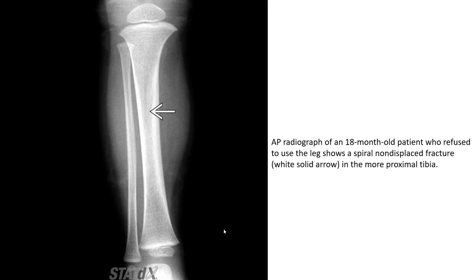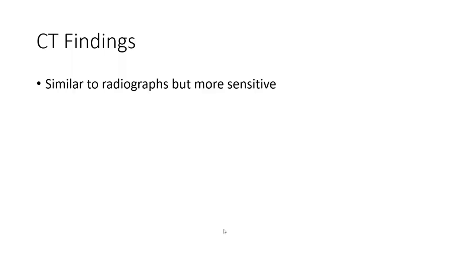AP radiograph of an 18-month-old patient who refused to use the leg shows a spiral non-displaced fracture, indicated by the solid arrow, in the more proximal tibia.